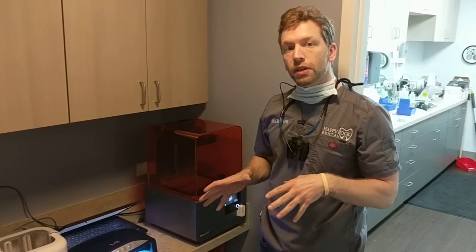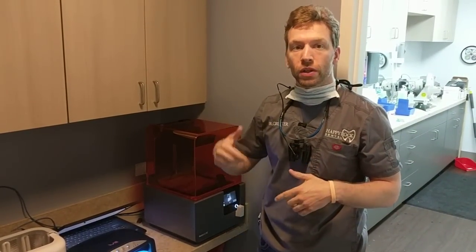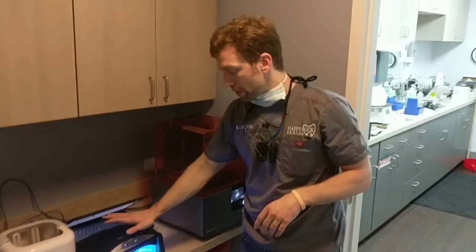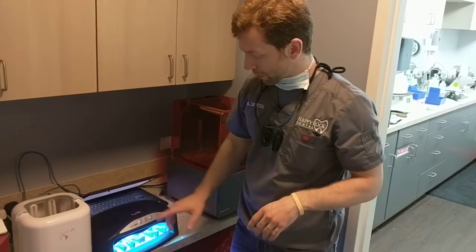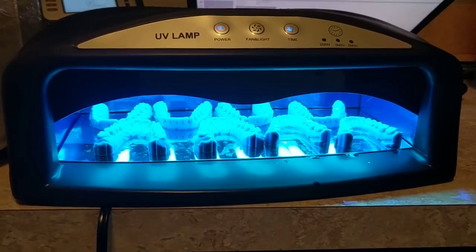We've finished printing our models and finished processing them. In the last video, I went over the wash technique. So now they've been sitting in our light. If you want to take a look down here, you can see we've got, not in any particular order, four uppers and four lowers.